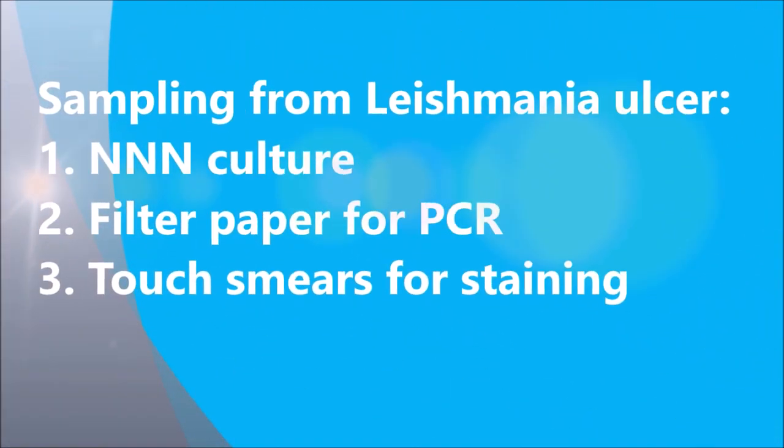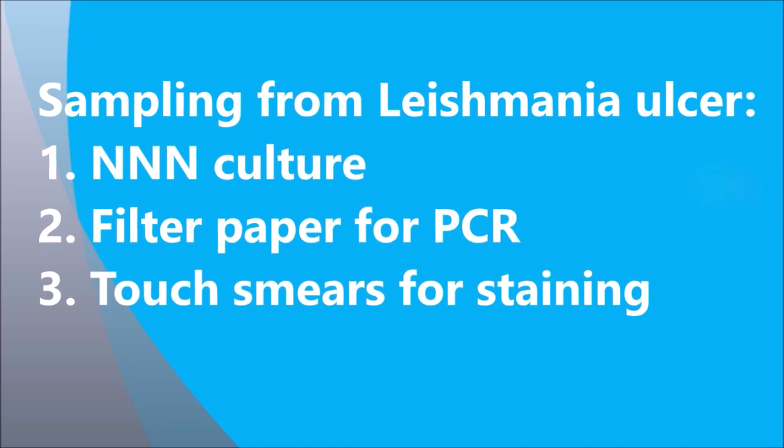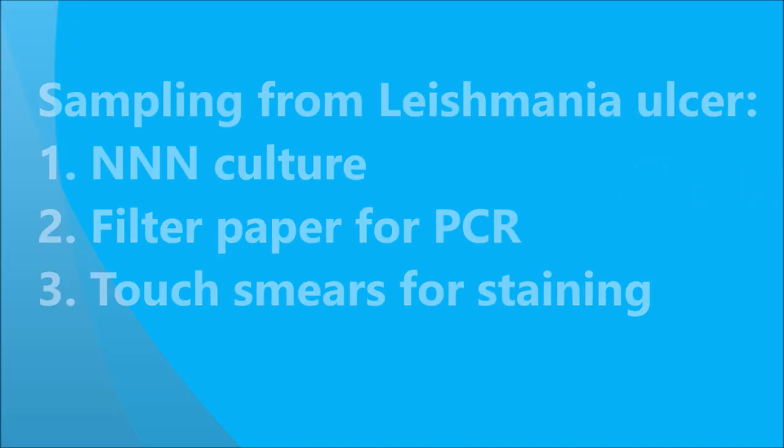Sampling from Leishmaniasis lesion. Three methods: 1. NNN culture. 2. Filter paper for PCR. 3. Touch smears for staining.